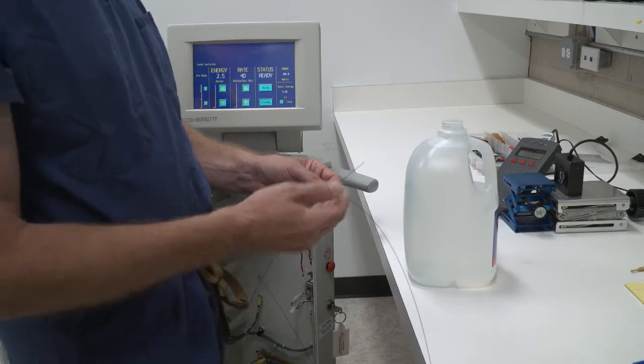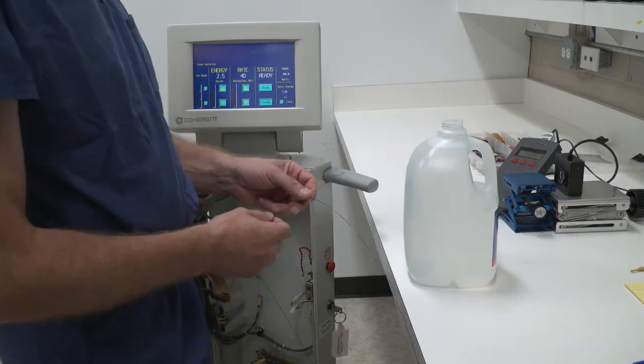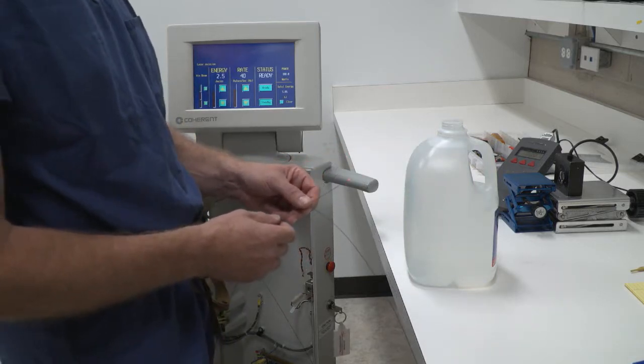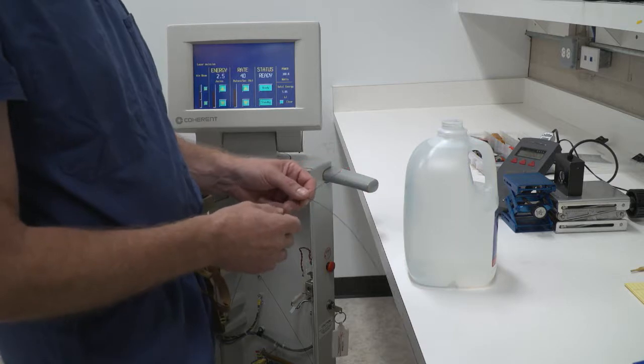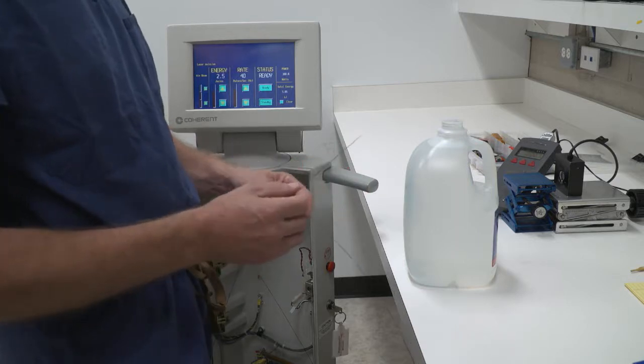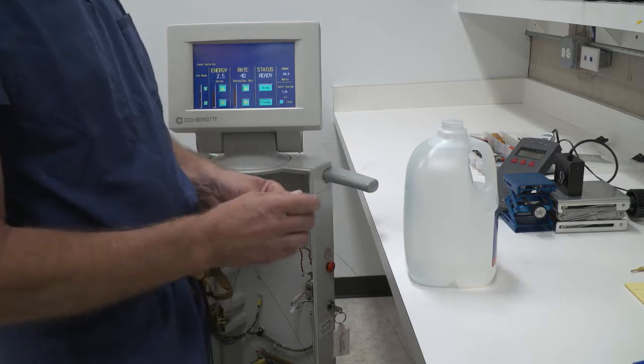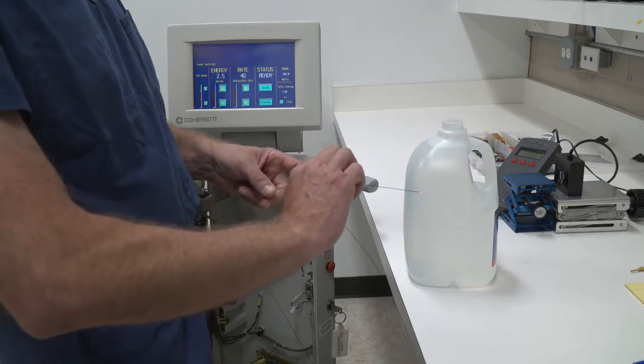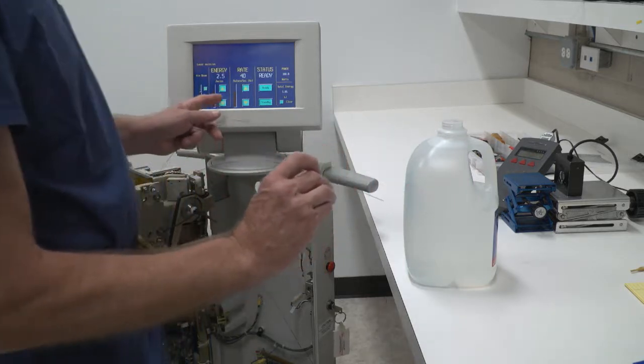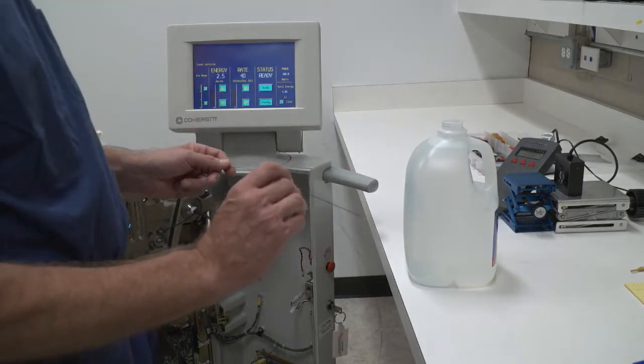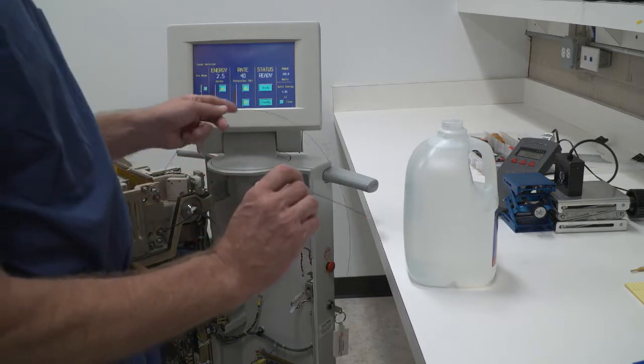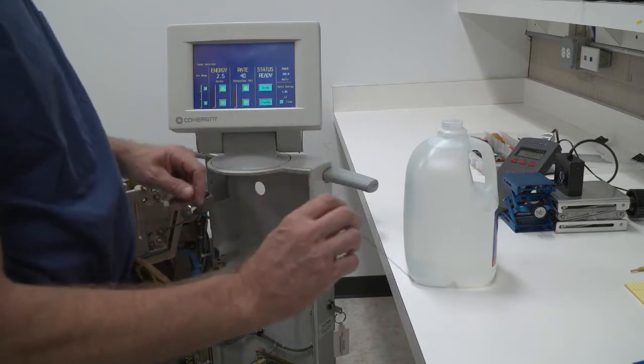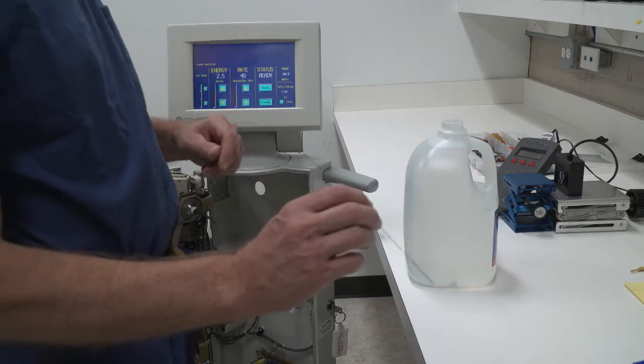I'm going to take my fiber and insert it into a gallon of deionized water. The deionized water will act as a coolant, keeping the tip of the fiber cooled down, and prevent damage to my fiber. So I'm going to select 2.5 joules per pulse at a rate of 40 pulses per second, equaling 100 watts of output power.